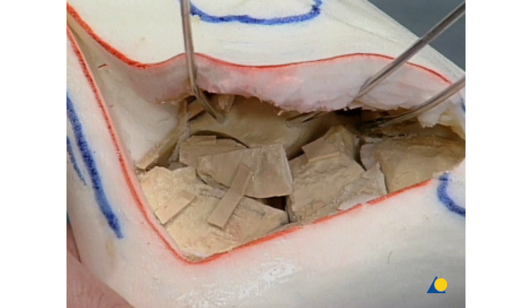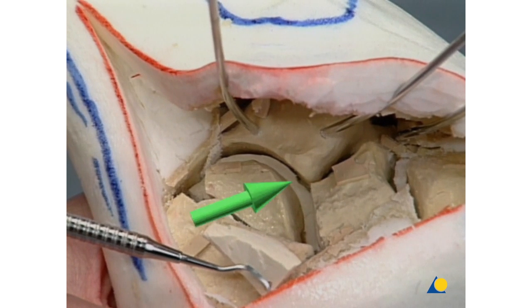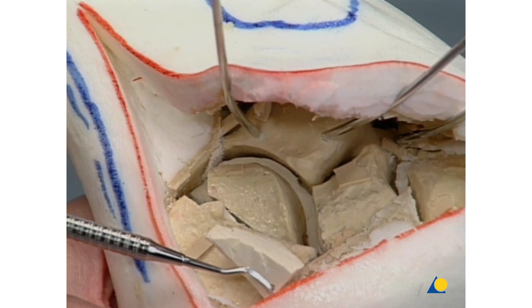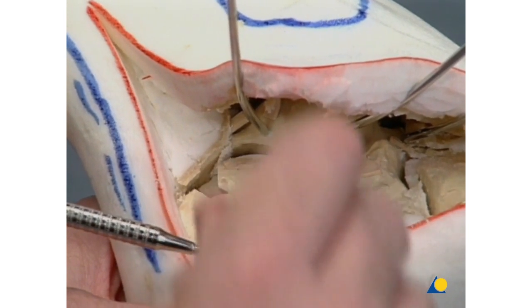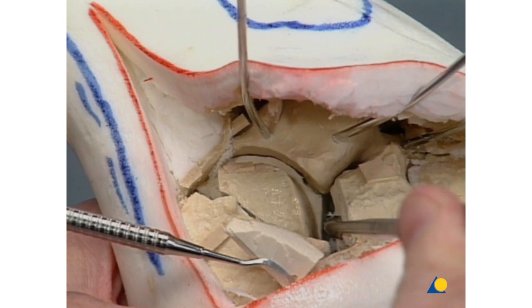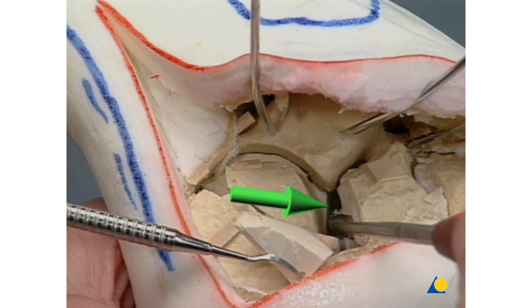On our model, we have to separate the different fragments and dislocate them. Applying manual varus stress on the posterior portion of the foot and retracting the lateral wall with the sharp hook, both joint-bearing fragments of the posterior facet are visualized. Here we can recognize the medial fragment of the posterior facet. The further mobilization of the fragments makes it possible to see the complete separation of the anterior calcaneal process from the posterior part of the calcaneus.